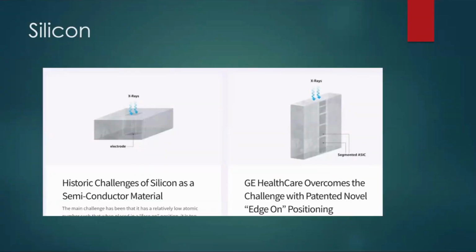And there are other vendors, of course, working on this. Siemens was the first to come out commercially. GE has been talking about it as well, and they're planning on using a different material, silicon. And this is just from their website, which you can read.